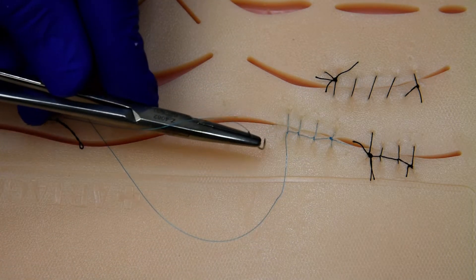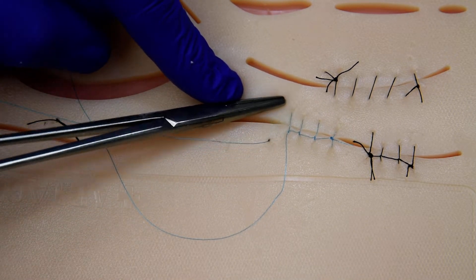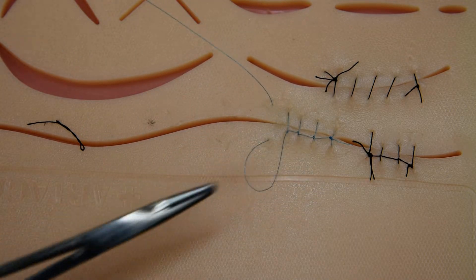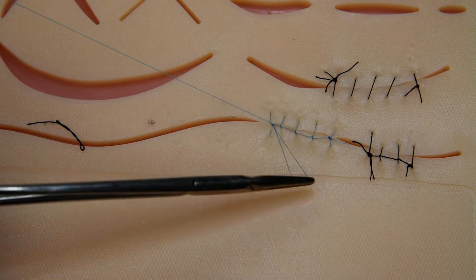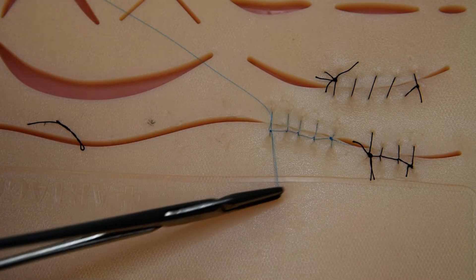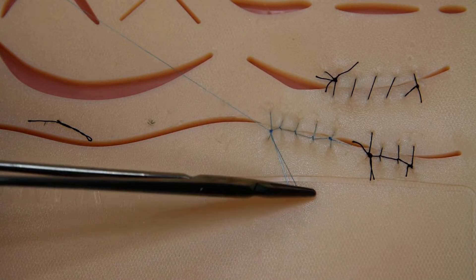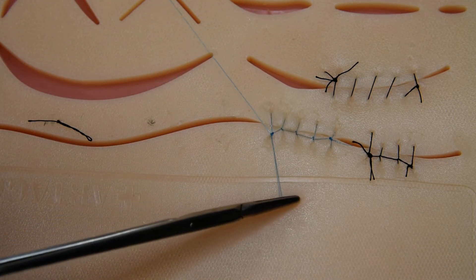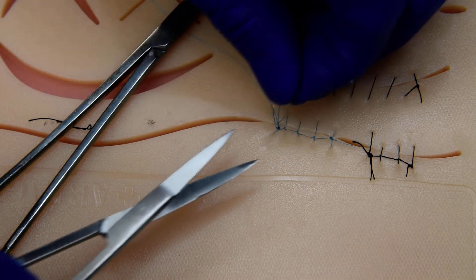We'll do one more and tie it off. We'll leave the loop long, enough for a tail, and we'll tie it off like the other two. And that's a double interlocking continuous. Go ahead and cut our three tails.